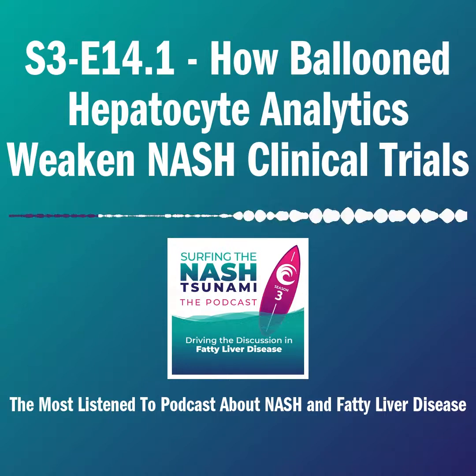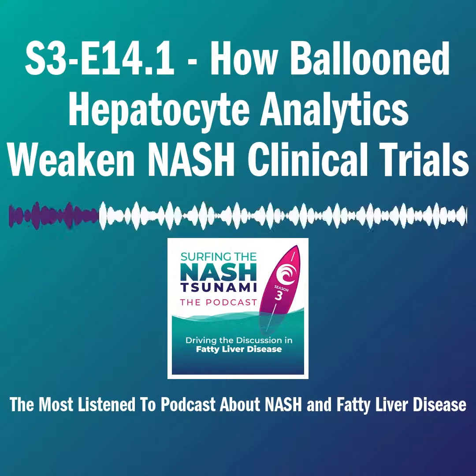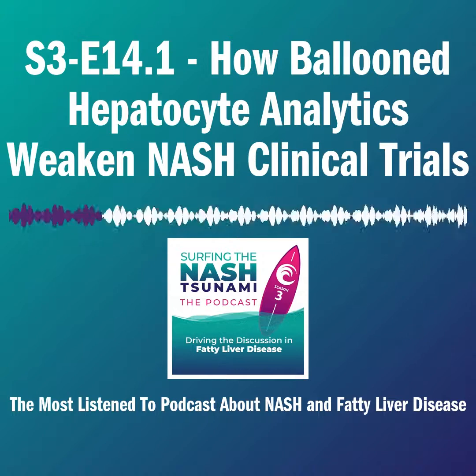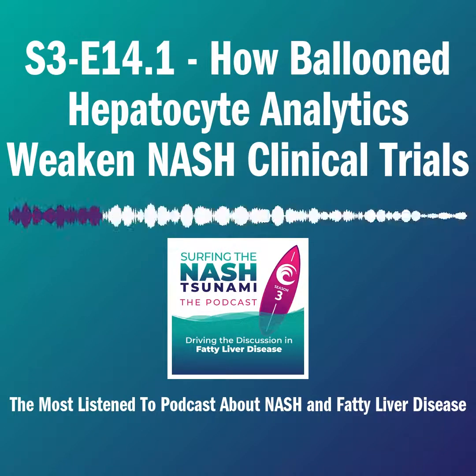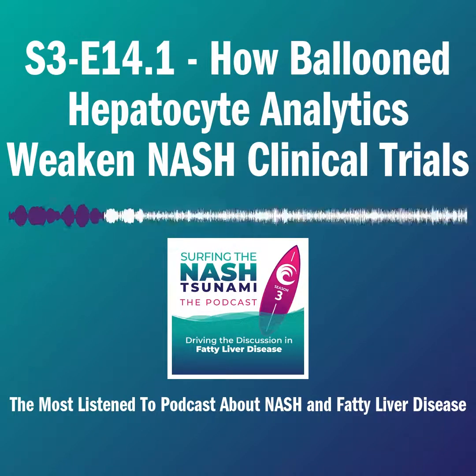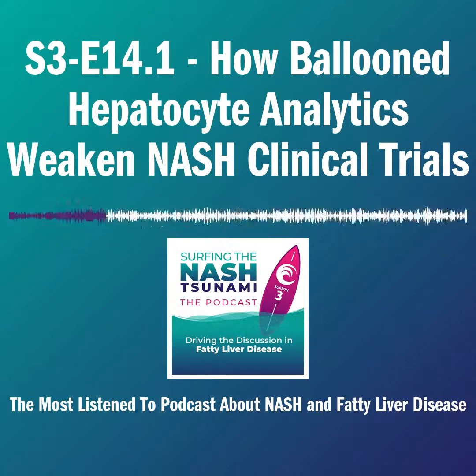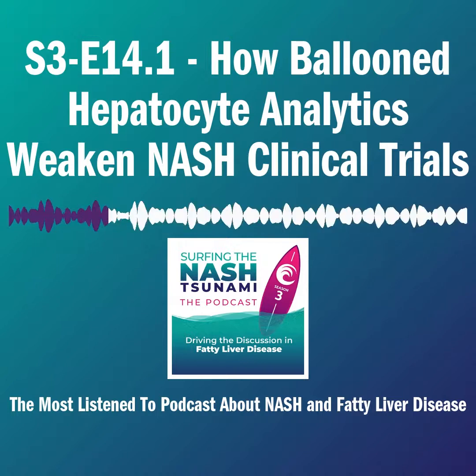With those papers, the big question is, well, is it how people apply a semi-quantitative scoring system? Is that where the challenge is? Or is it more fundamental than that? Is it actually the case that people are seeing different things down the microscope? And is that what's contributing to the variation that has been described when these semi-quantitative scores are applied?